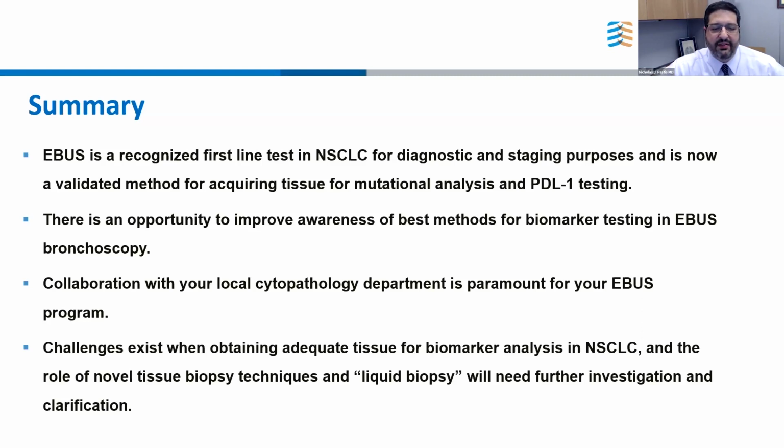And then we talked about some of the challenges presented to us in a clinical setting: frailty of some of our patients, tumor heterogeneity, a need for repeat biopsies that prompt us to think of another alternative like liquid biopsy. And this will need further investigation, and the exact role will be clarified over the next decade or so. So I think Adam has been collecting questions from the chat, so I'll stop there.